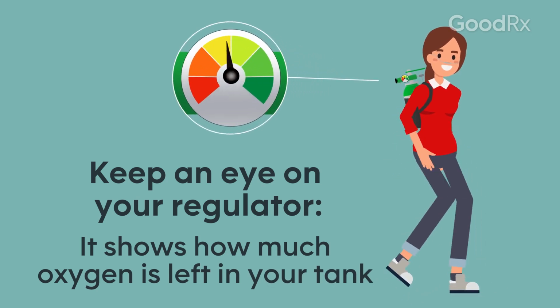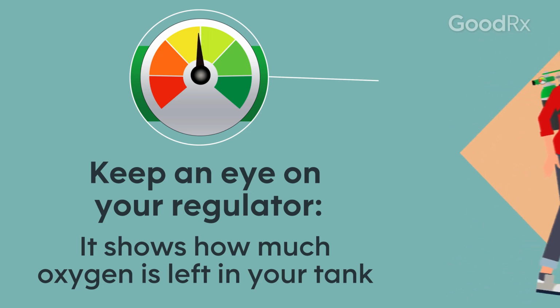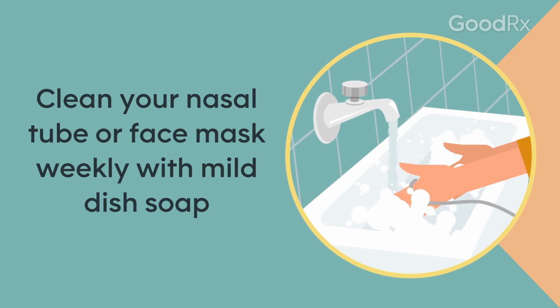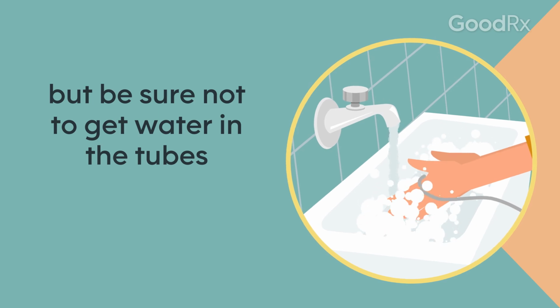Keep an eye on your regulator. It shows how much oxygen is left in your tank. Clean your nasal tube or face mask weekly with mild dish soap. But be sure not to get water in the tubes.